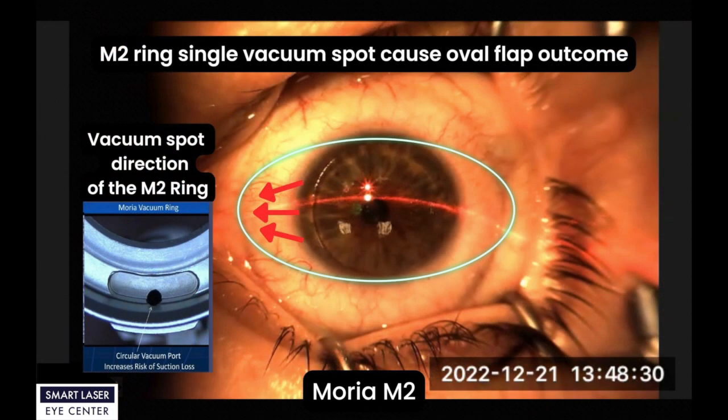Another finding about the M2 ring is that there is only one vacuum spot under the M2 ring. During the vacuum procedure, the elevated vacuum may pull the subconjunctiva to the vacuum spot. This may cause an oval flap outcome after the flap is cut.